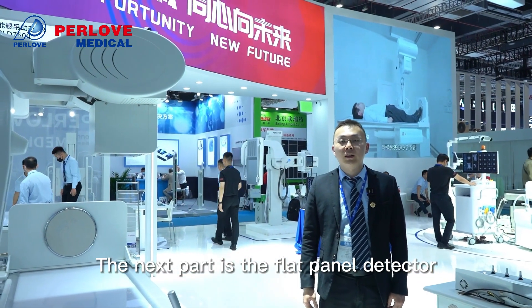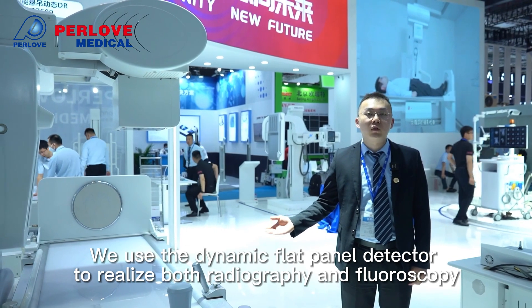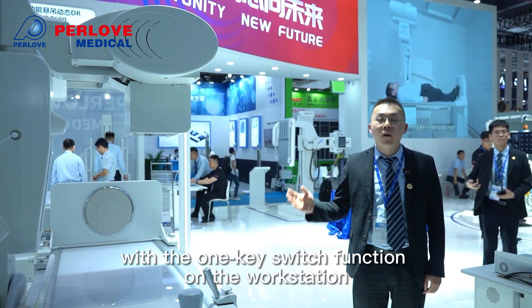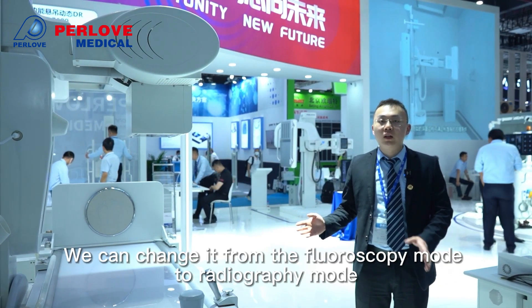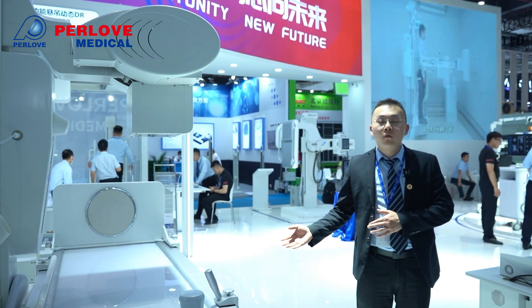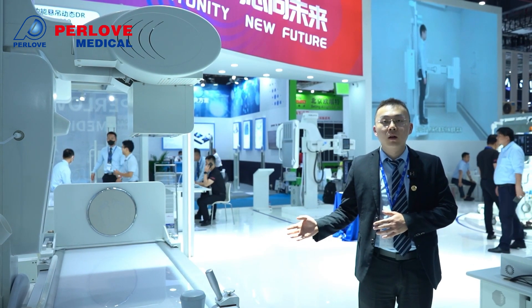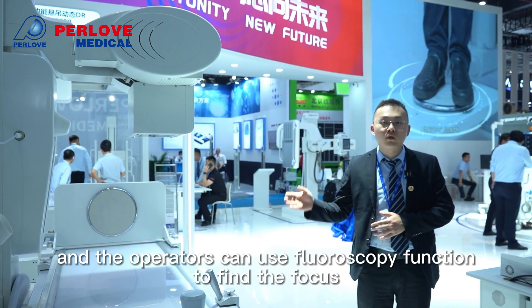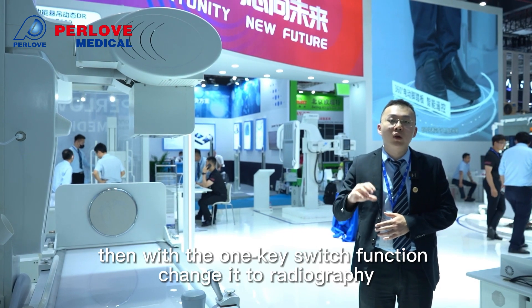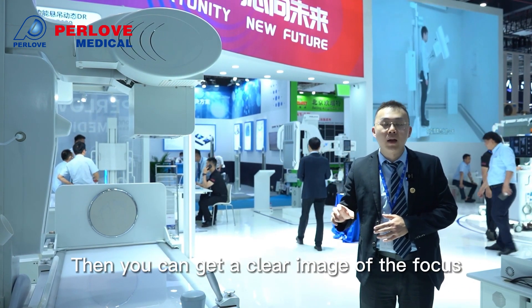The next part is the flat panel detector. We use a dynamic flat panel detector to realize both radiography and fluoroscopy. With the one-key switch function on the workstation, we can change from fluoroscopy mode to radiography mode. For patients with some unknown focus, the operator can use the fluoroscopy function to locate it, then with the one-key switch, change to radiography to get a clear image of the focus.